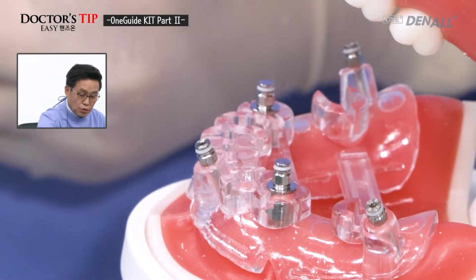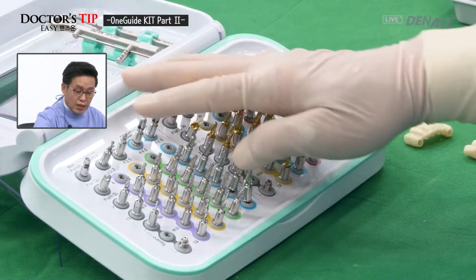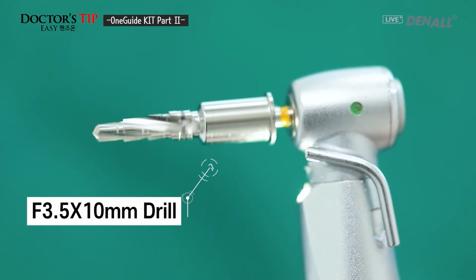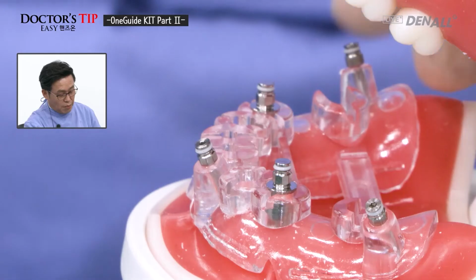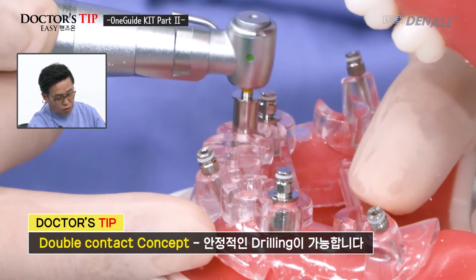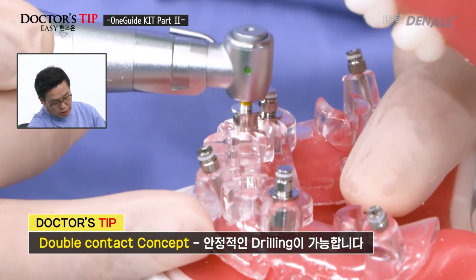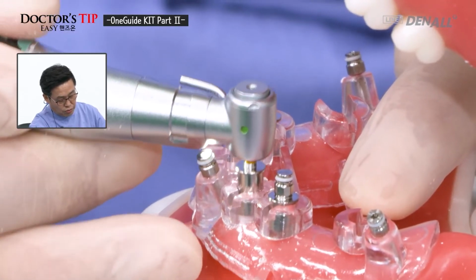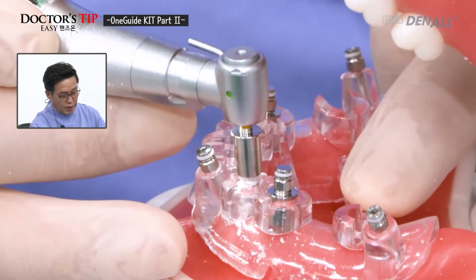Initial drill 3.5, this is short, and then I'm going to place 4.0 by 10 millimeter, so I'm going to choose 3.5 by 10 millimeter drill. As mentioned before, double contact concept. It is in contact with the bone as well as the template, and therefore 10 millimeter hole is made full length drilling. This is the same for this canine as well. Full length drilling is done.